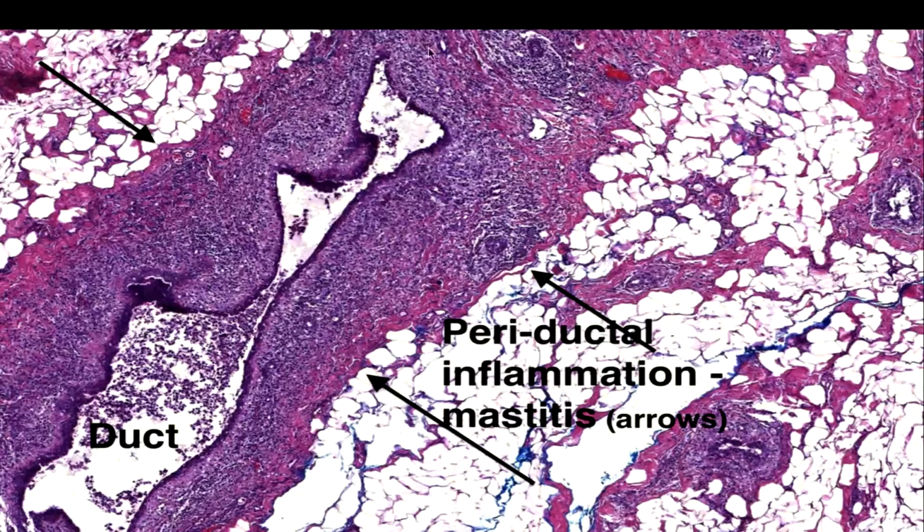We saw this whole thing as a straight line on tomo, and so now we've got gray and then white and then gray. We could easily think that if we're looking at it whole, this is actually one of those spoke wheels.